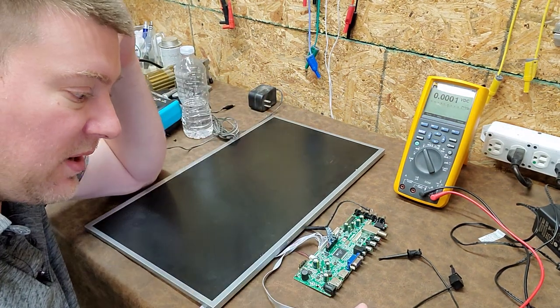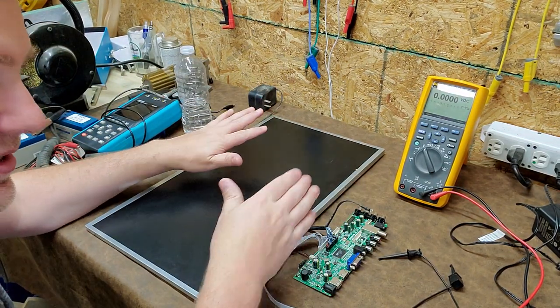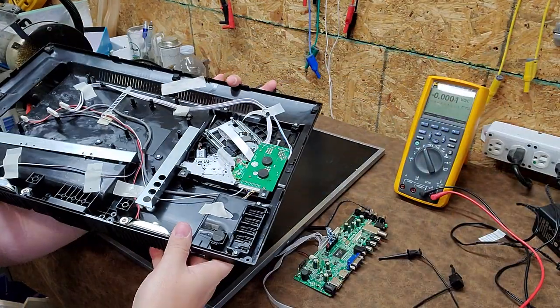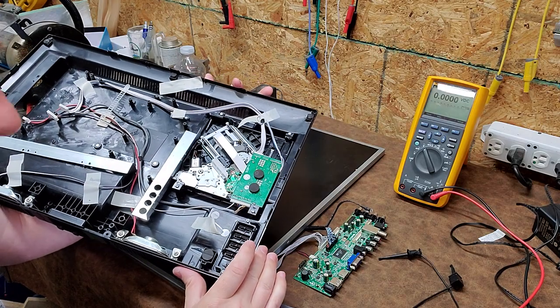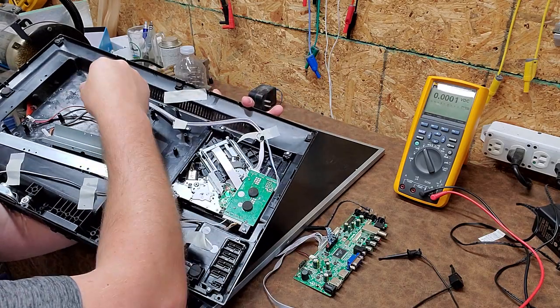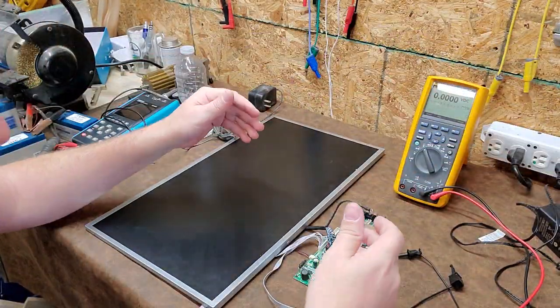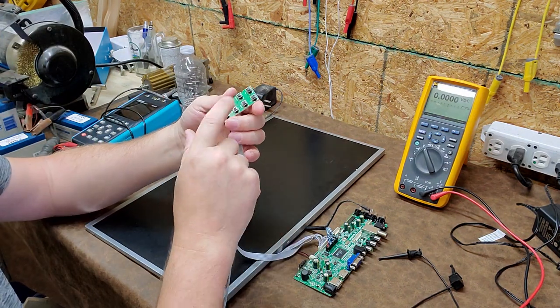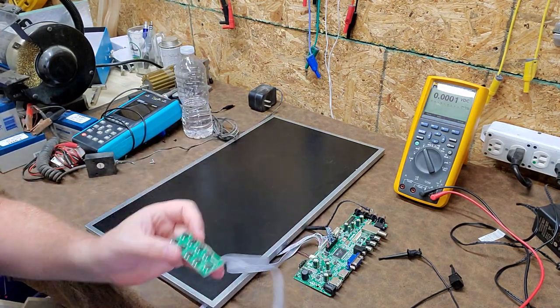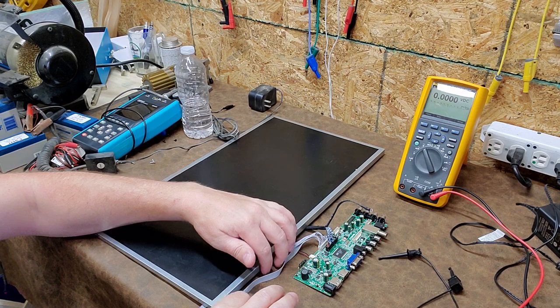So the initial complaint was that the unit does not power on. I found a couple things that were a little suspect. You can see I've got the panel outside of its chassis. I've got the chassis sitting right here. And this also has an integrated DVD player, which none of that is necessary for testing the symptom that it's not powering on. So you can see I unplugged all the accessories from the main power board. And the only thing I really need is this little daughter board right here, which runs your remote signal, which is also the power button. So I need this board. You can see I've got other cables that do not necessarily connect.